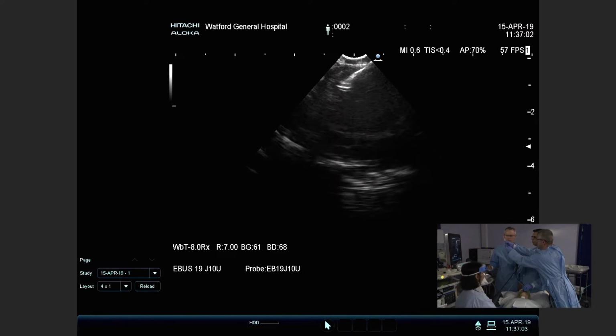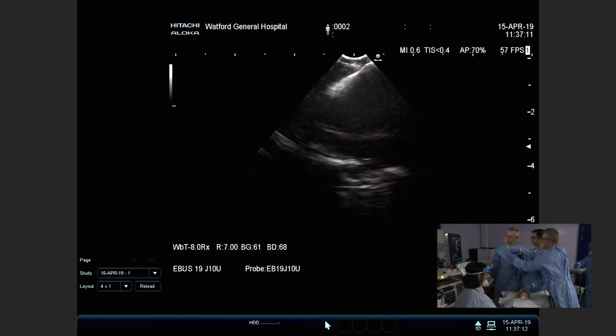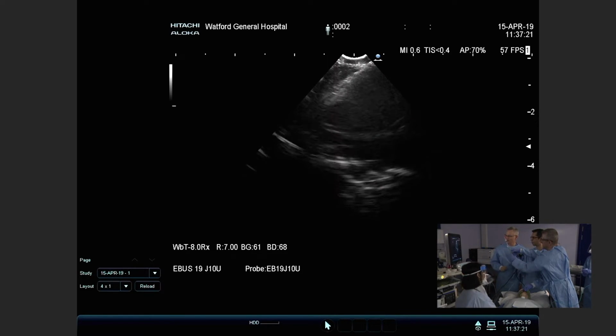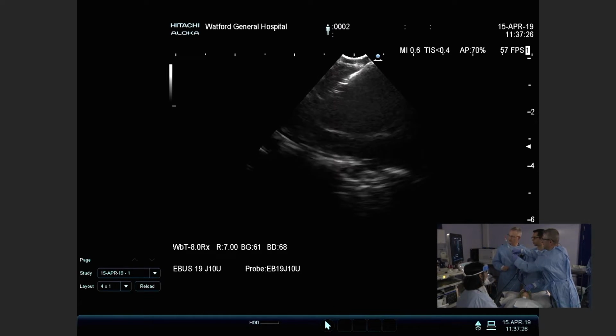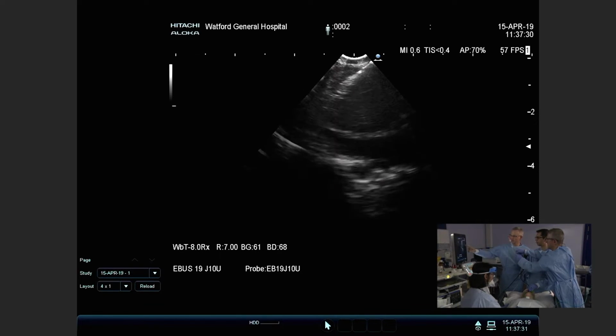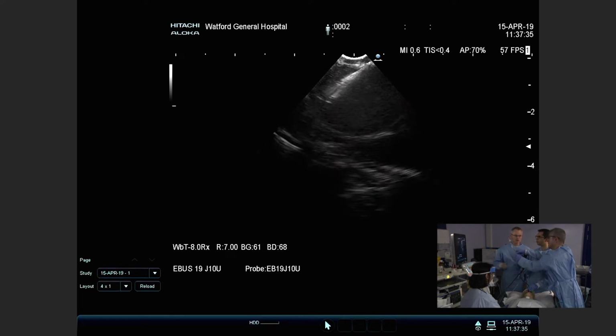This syringe is preset with suction or vacuum. Now we're just going to biopsy the node. So these are very nice, slow agitations, going back and forth. We like to go from edge to edge, so all the way back and all the way forward. And I guess just like in EUS, it's important to visualize the needle tip. Absolutely, the tip of the needle is the most important area to visualize.